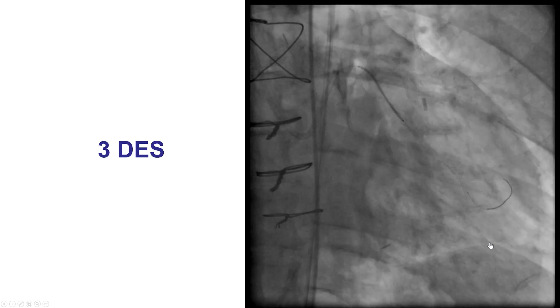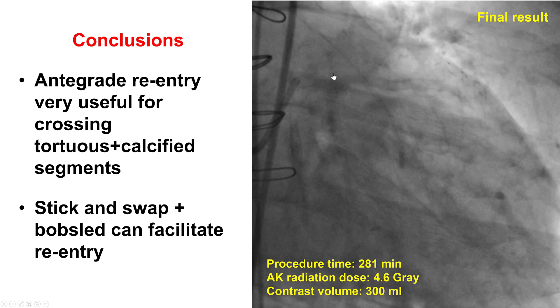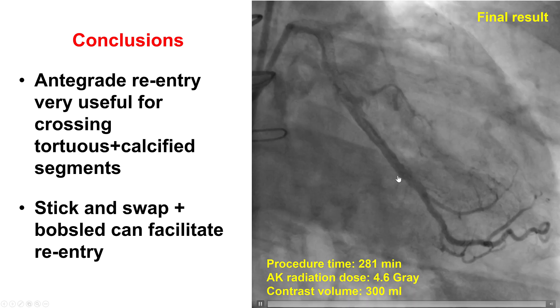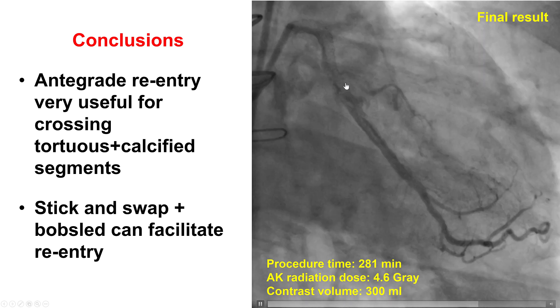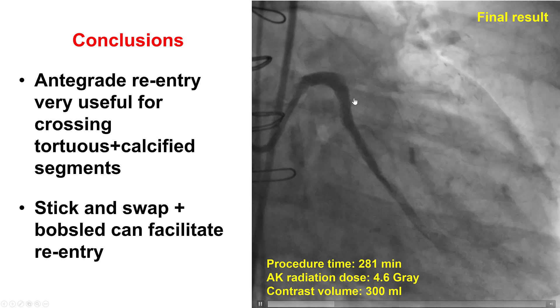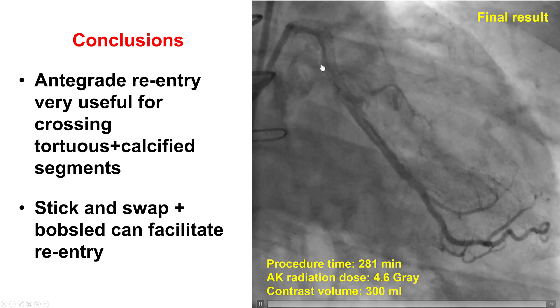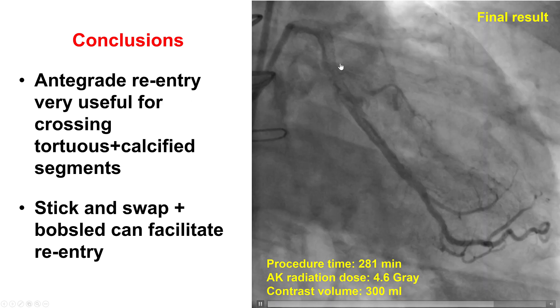After this, the Pilot was exchanged for a workhorse guide wire and drug-eluting stents were placed all the way from the obtuse marginal to the ostium of the left main, providing a nice final result with TIMI flow into the first obtuse marginal. Interestingly, an earlier small marginal branch actually remained patent despite the dissection re-entry technique used for recanalizing the vessel.